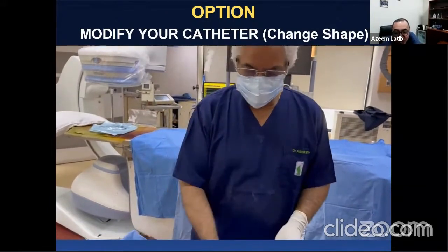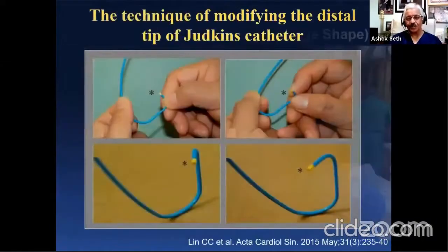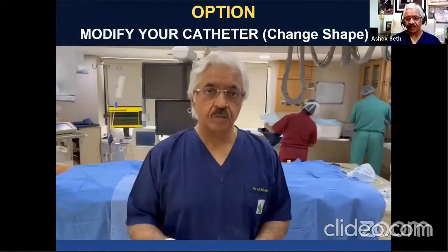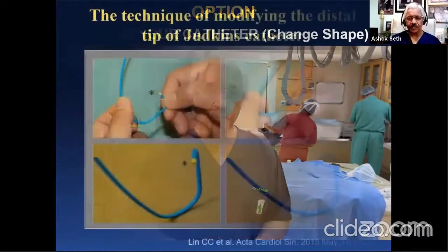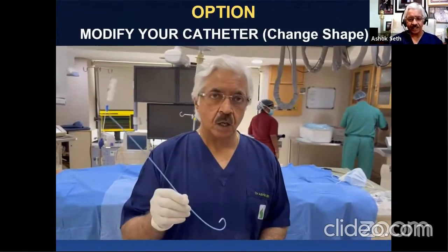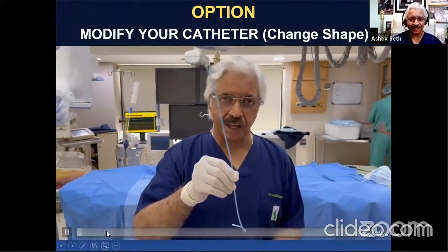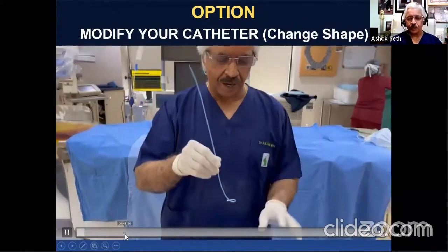Great. So, with diagnostic catheters I'll just show you one more. And before that, then we'll have that comment from you. I'm not going to show you a long video, but I just wanted to show you that you actually get the specialty catheter that I created in the cath lab. But look at what you can do.